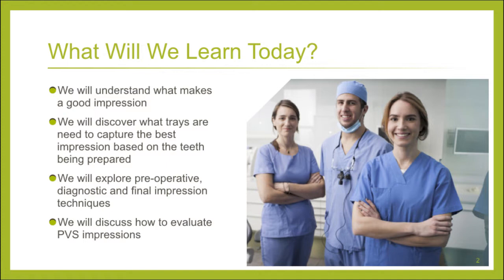We're going to go through what are the things that we're going to say to those patients. We're going to talk about impression trays, whether it's a preoperative impression. We're going to talk about the final impression, hemostasis, controlling any type of fluids that the patient may have, and how do we get a really good final impression.